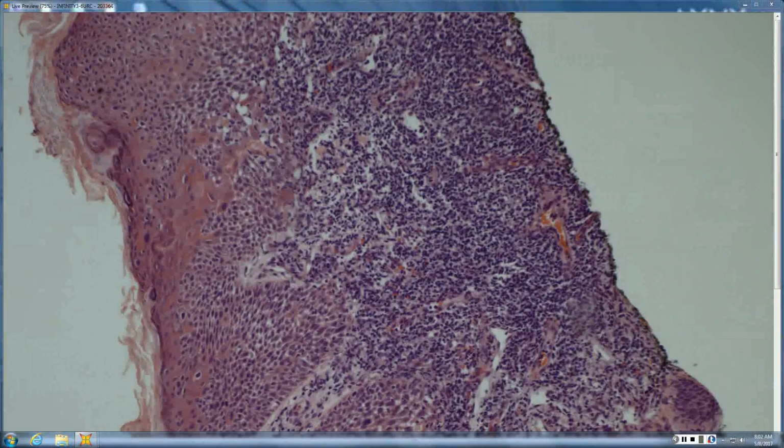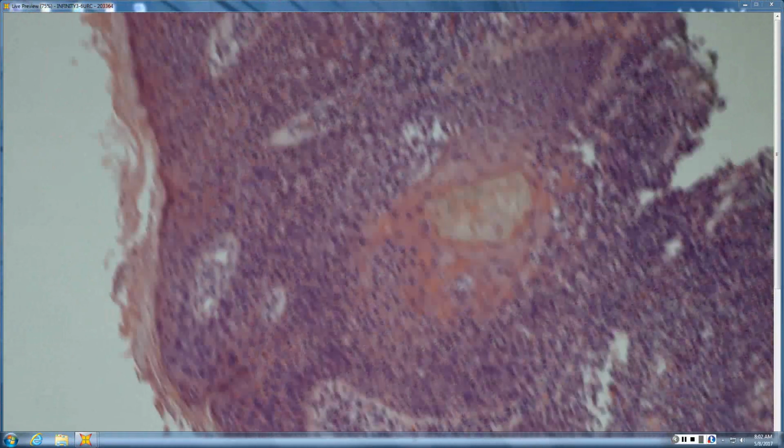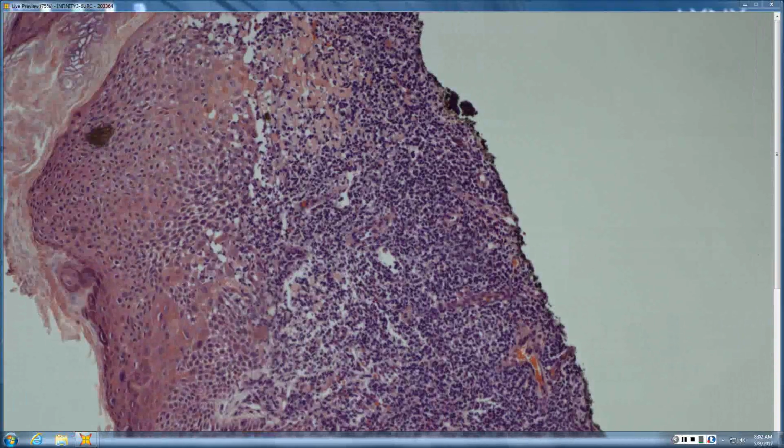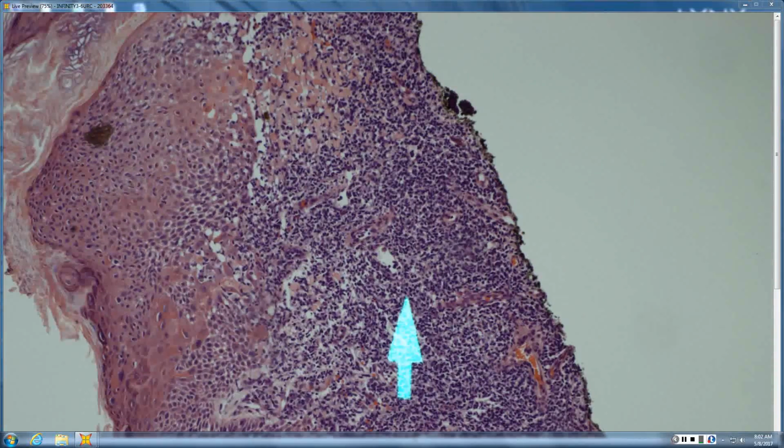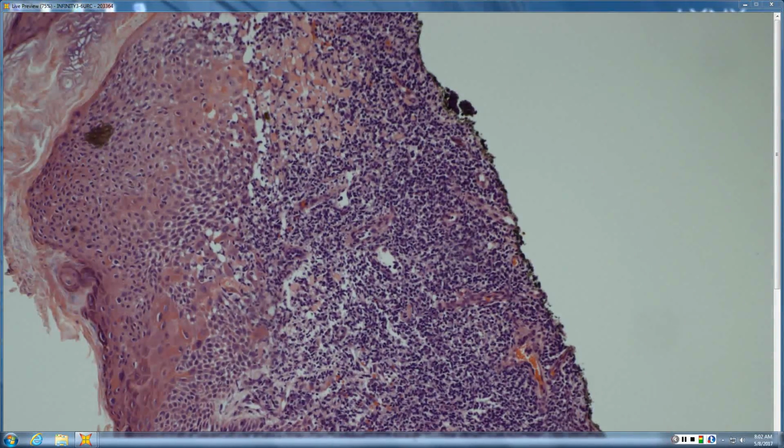Okay. So this looked like focal lesions, well demarcated. It looks like a significant amount of interface. So there's a lot of interface, right, and lots of dead reds. And then we look at the epidermis. So the question is, is this primary? What's primary, what's secondary?